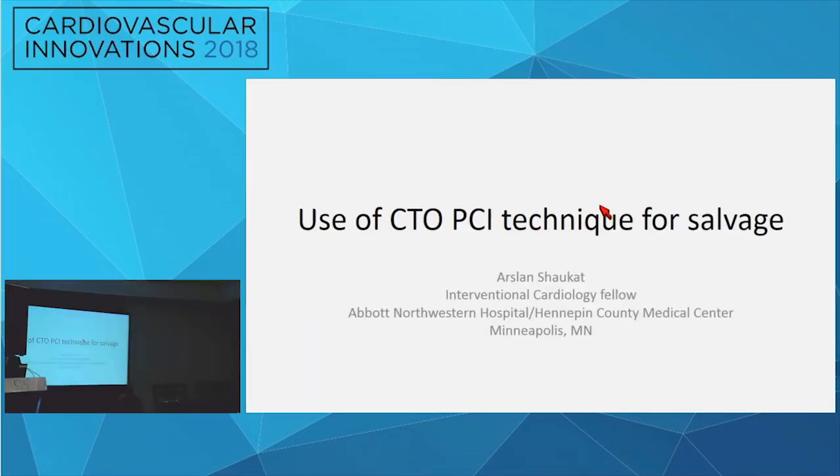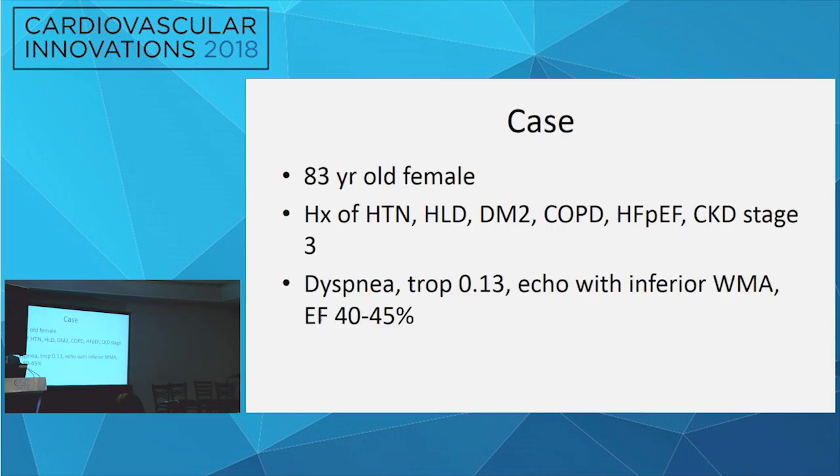I recently completed my interventional cardiology fellowship at the Minneapolis Heart Institute and Hennepin County Medical Center in Minneapolis, and this was one of the cases during my fellowship. The title of my case is Use of CTO PCI Technique for Salvage.